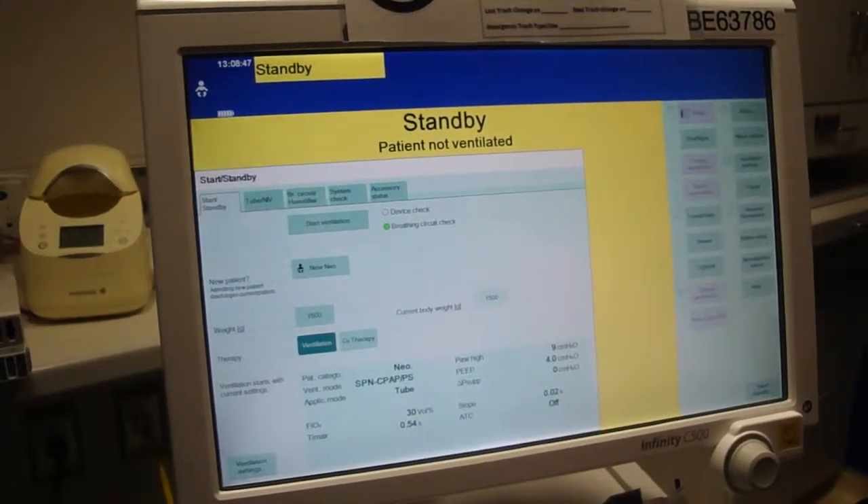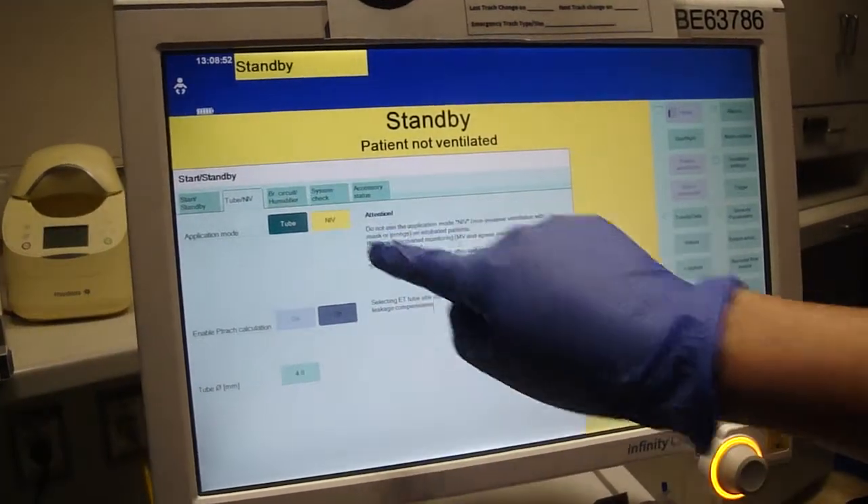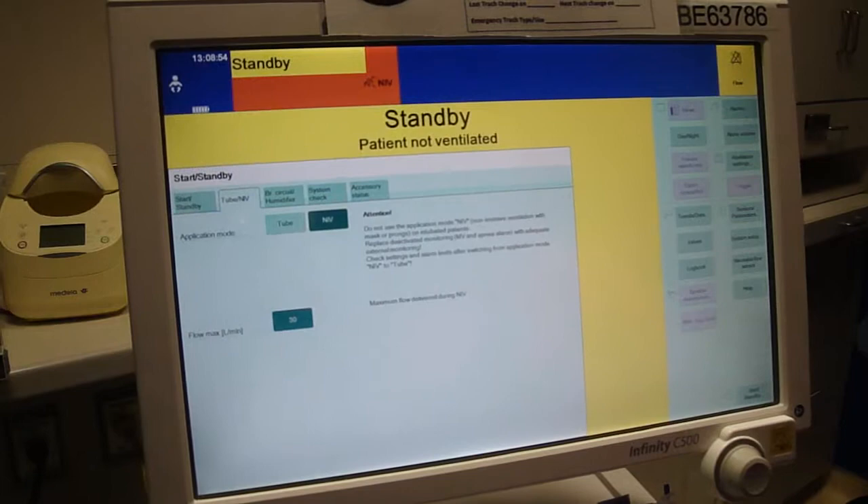In the Start Standby screen, select Tube, then NIV. Select NIV and confirm. We're now in the NIV mode.